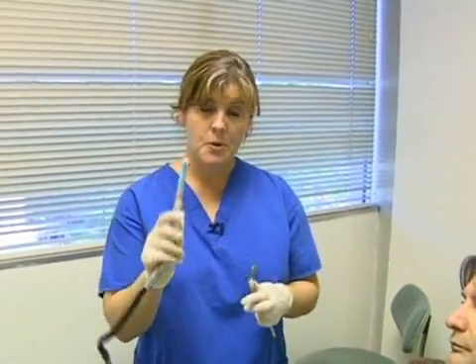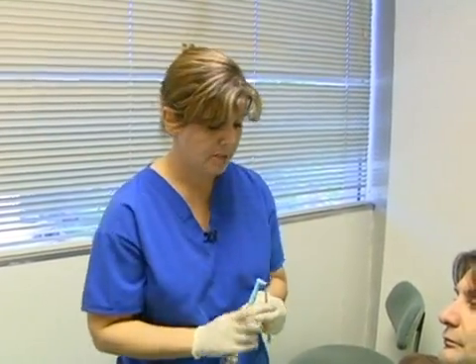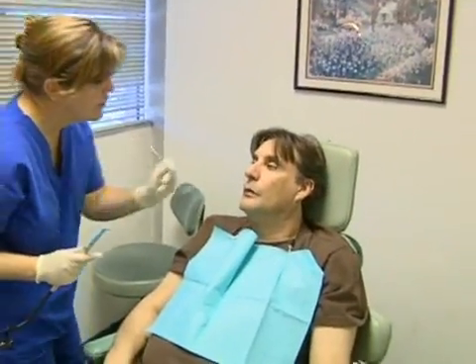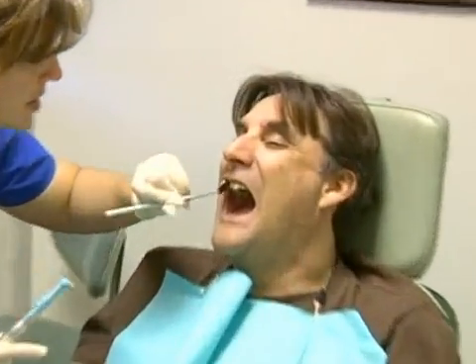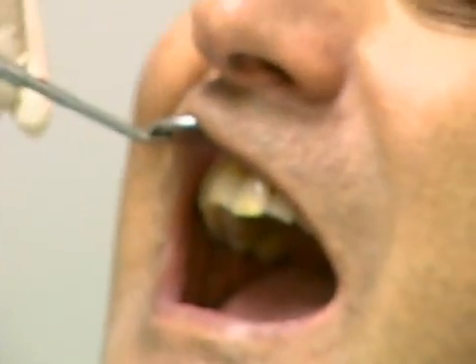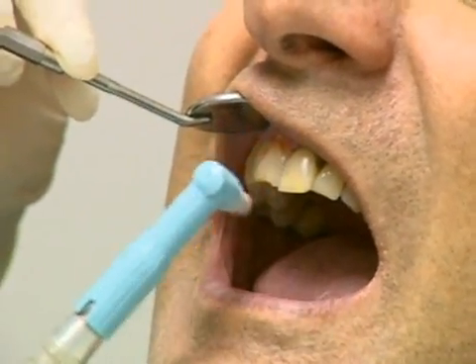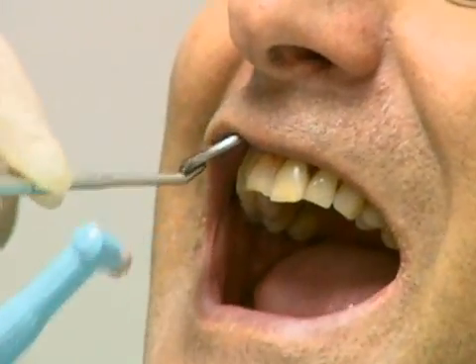So now what we're going to do is put this on the patient's mouth. We're going to use the mirror and retract his gum just a little bit, like this, and hold it up. Then use the handpiece and do just a big old swipe right here from up to down, right in the middle part of the tooth.